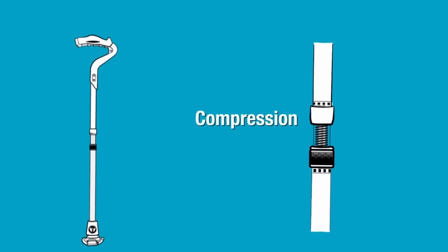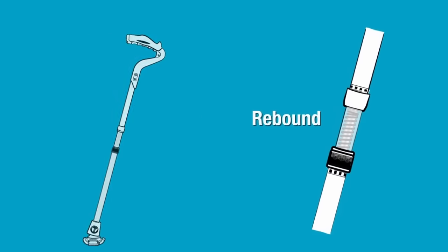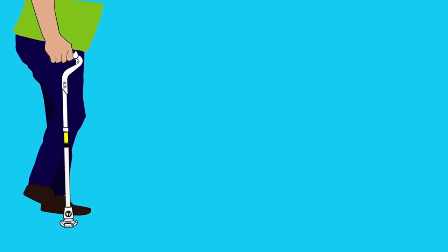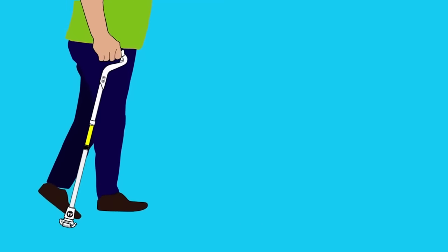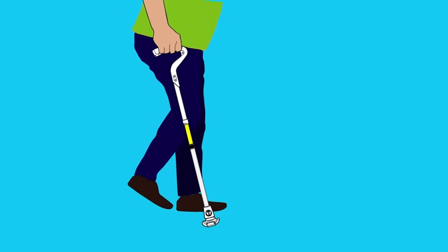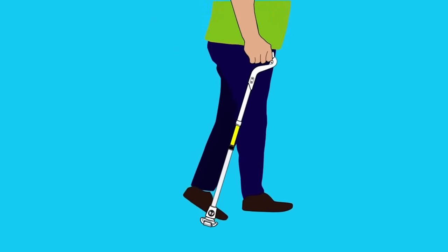Shock absorber and rebound effect. As you can see, as the user keeps his hand in the exact same spot, the user advances, and when the user bends the knee, the shock absorber system kicks into play and will help push the user forward on the way up.